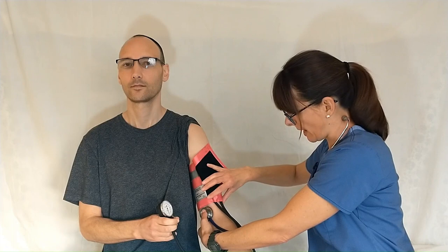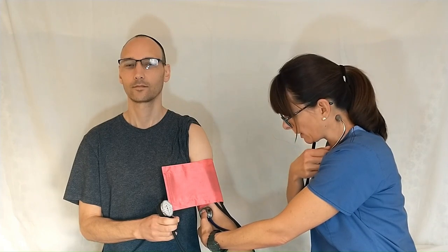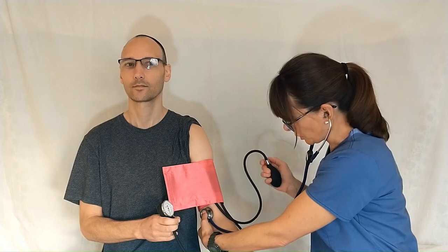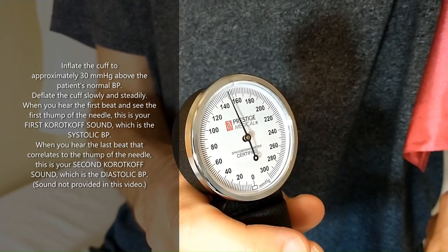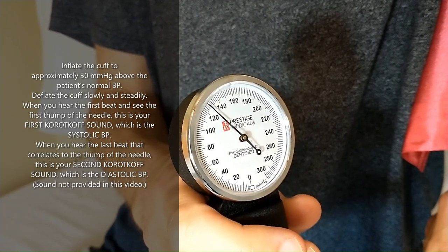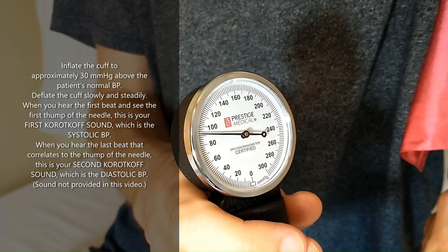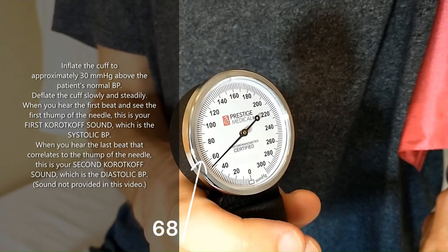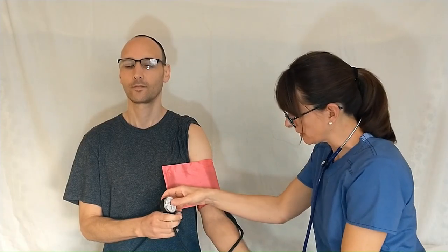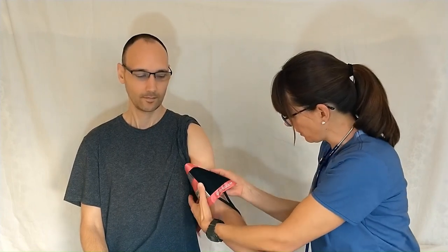I like the version where you're really able to hold it and press it against the patient's skin — of course being very gentle. I can let this go now because I have a good view of my sphygmomanometer. I put my earpieces in and start to inflate the cuff. My reading was 108 over 68, which is normal. I'll remove the blood pressure cuff from the patient.